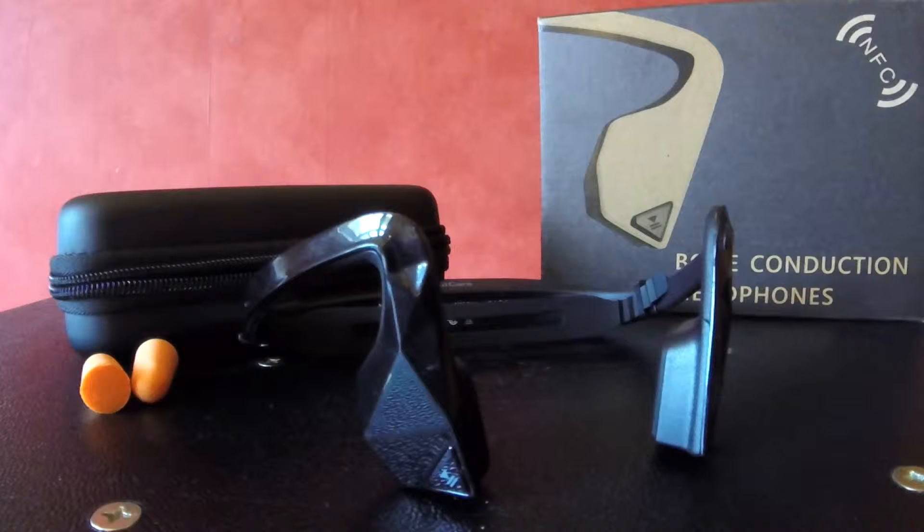Why would you want these things? Well, imagine you're cycling. A lot of people cycle these days, and it's dangerous not to be able to hear the traffic around you. With these, your ears are wide open, but you can still hear music because it travels through your bones.